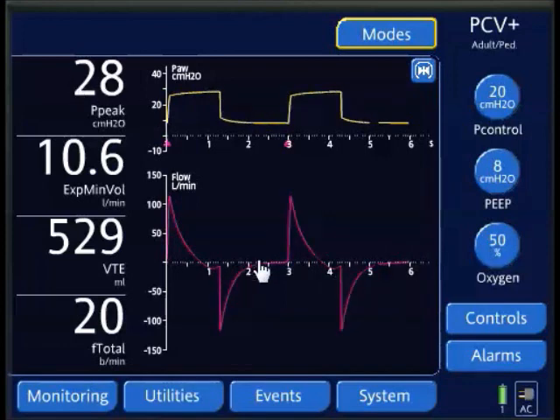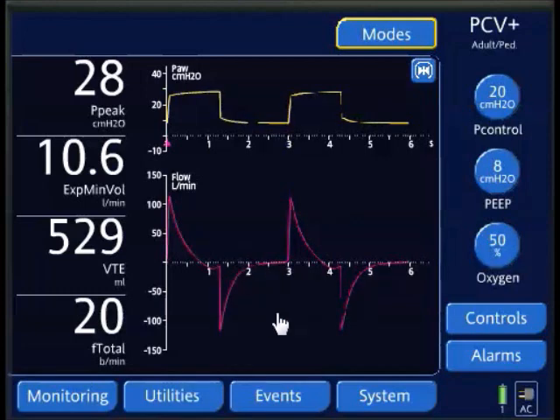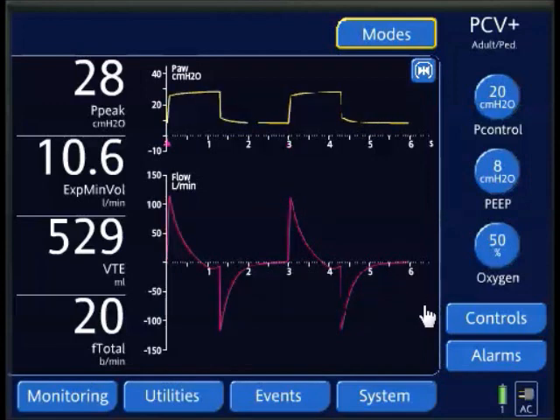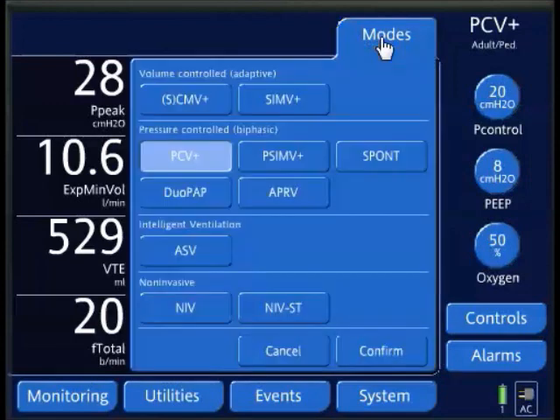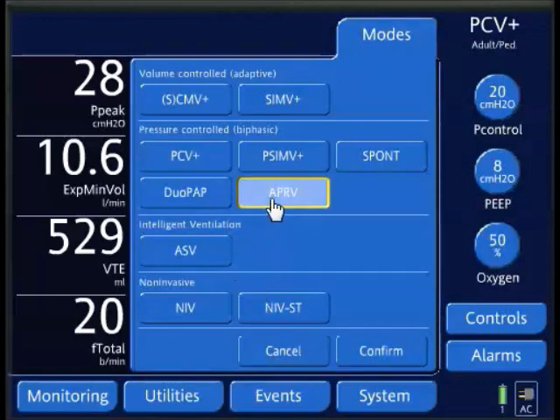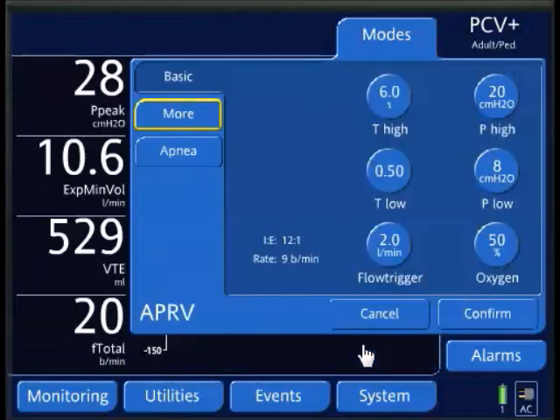Let's say my plateau pressure is 28. I want to set up my P-high in APRV, approximately 2 centimeters of water above this. I'm just going to go to my modes. I'm going to select APRV and confirm it.